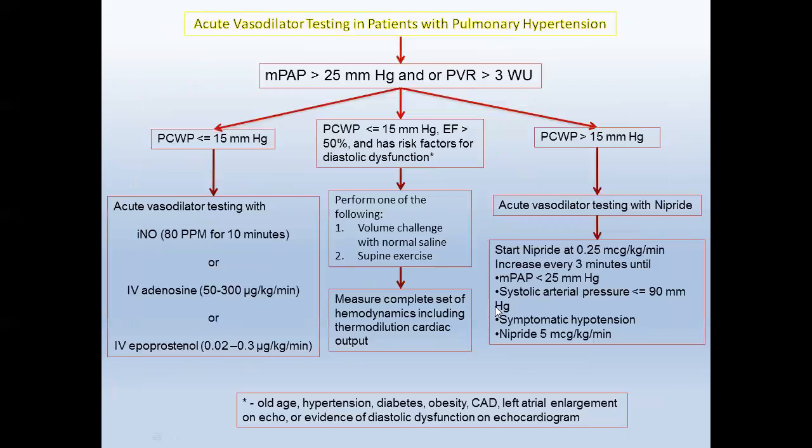Now, what if your wedge is high? Why in group 3? We've gotten into the debate before in the cath lab. Someone was coming for a lung transplant. I understand from the cardiac side, you need to make sure that the transplanted RV can tolerate the increased resistance. But if you are looking at pre-transplant or other parenchymal lung problems, what is the benefit of doing vasodilator therapy?